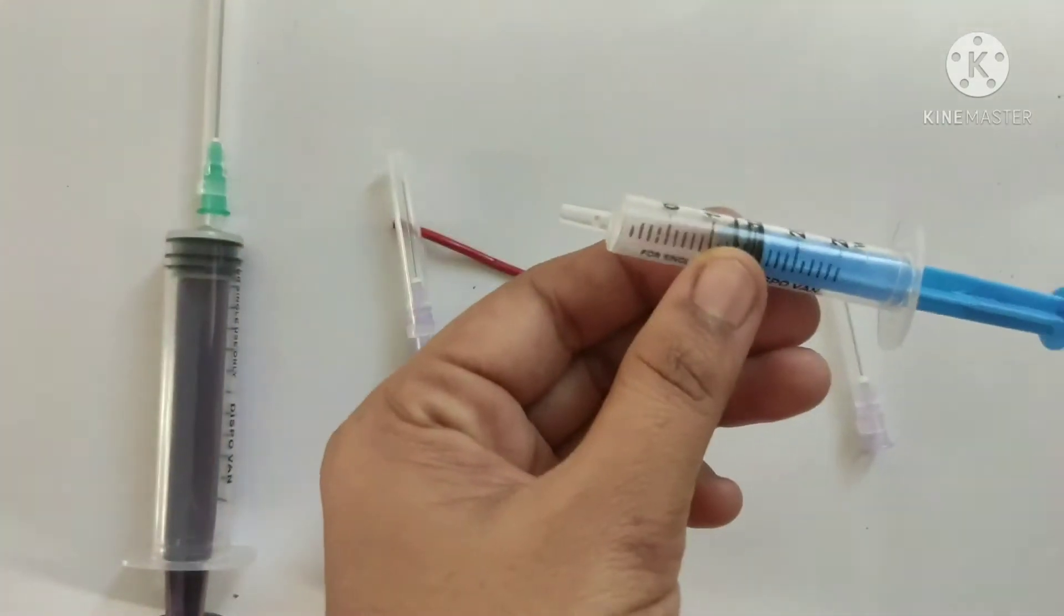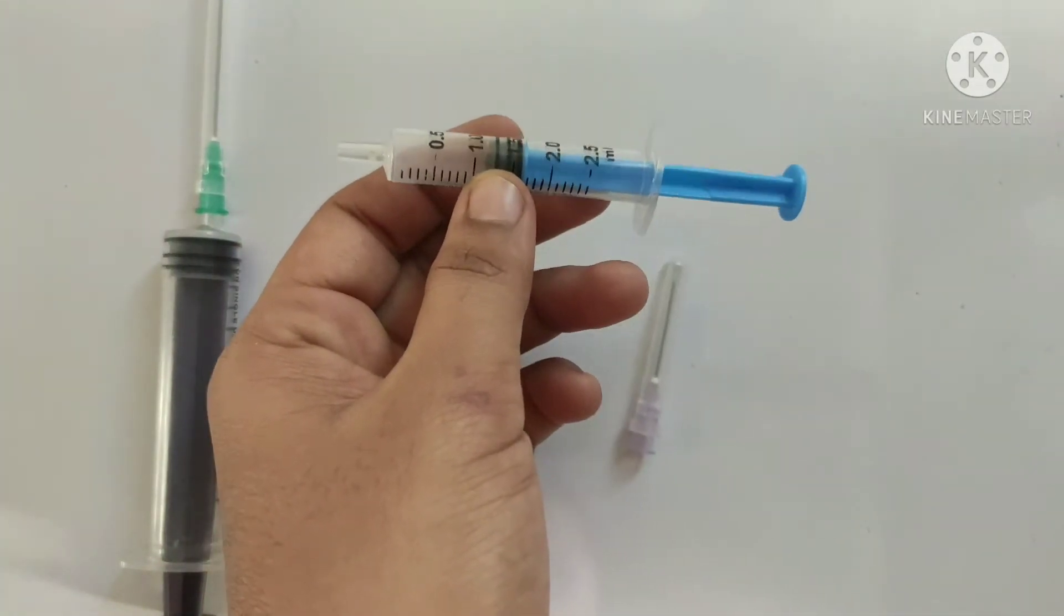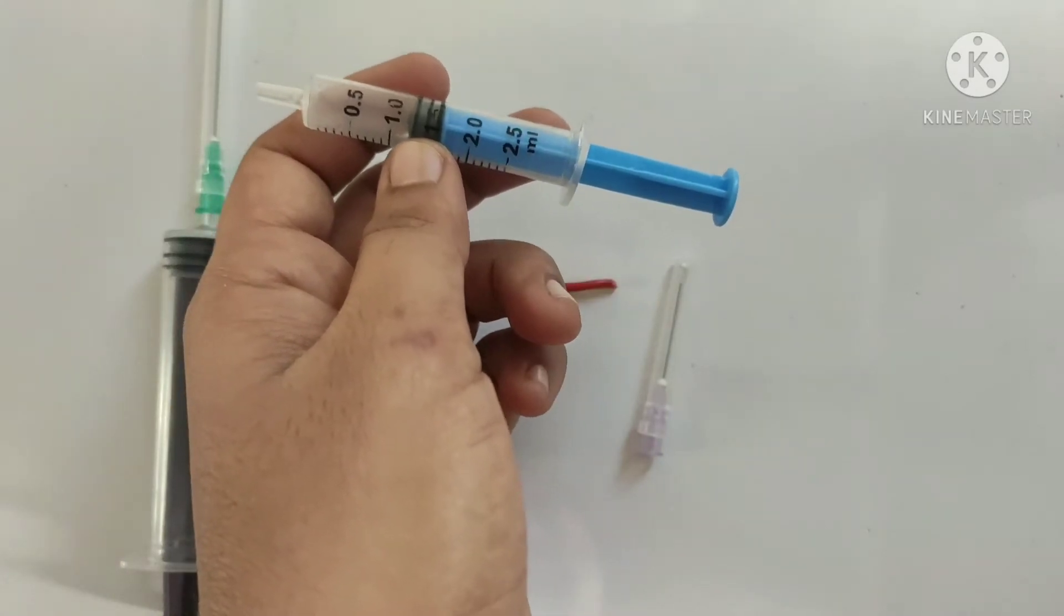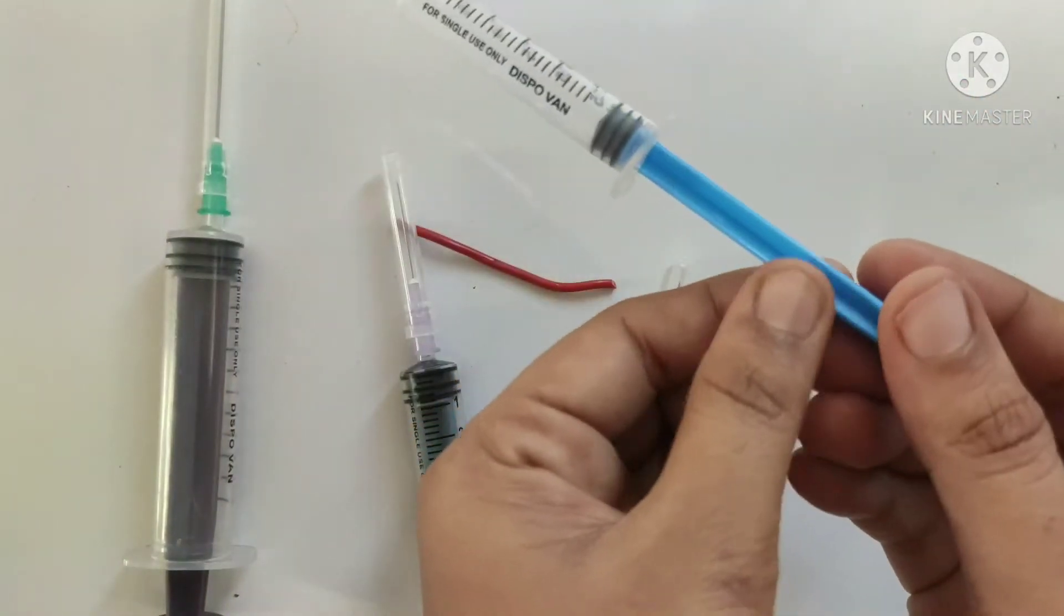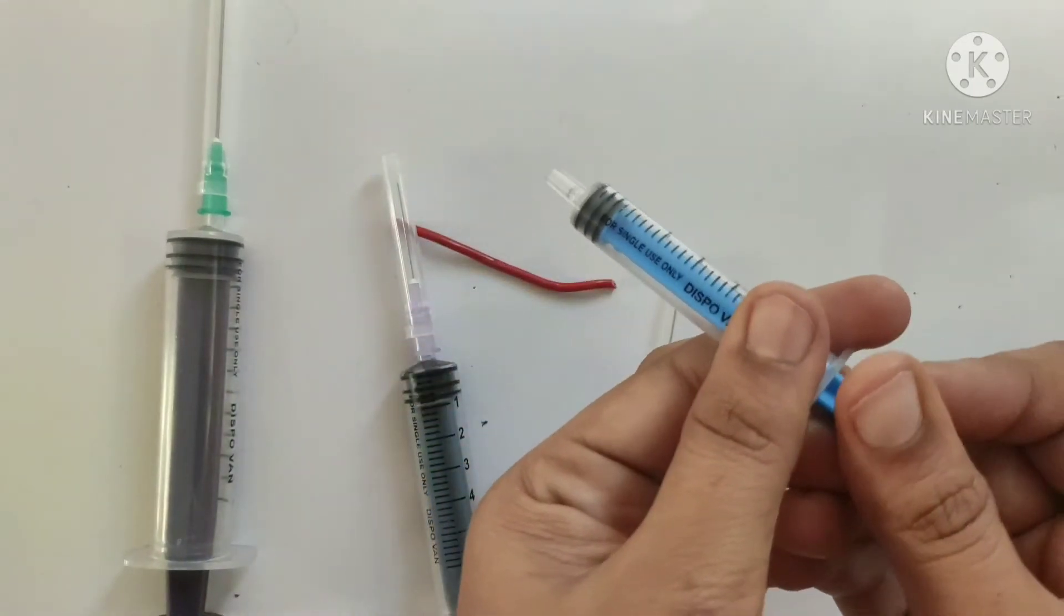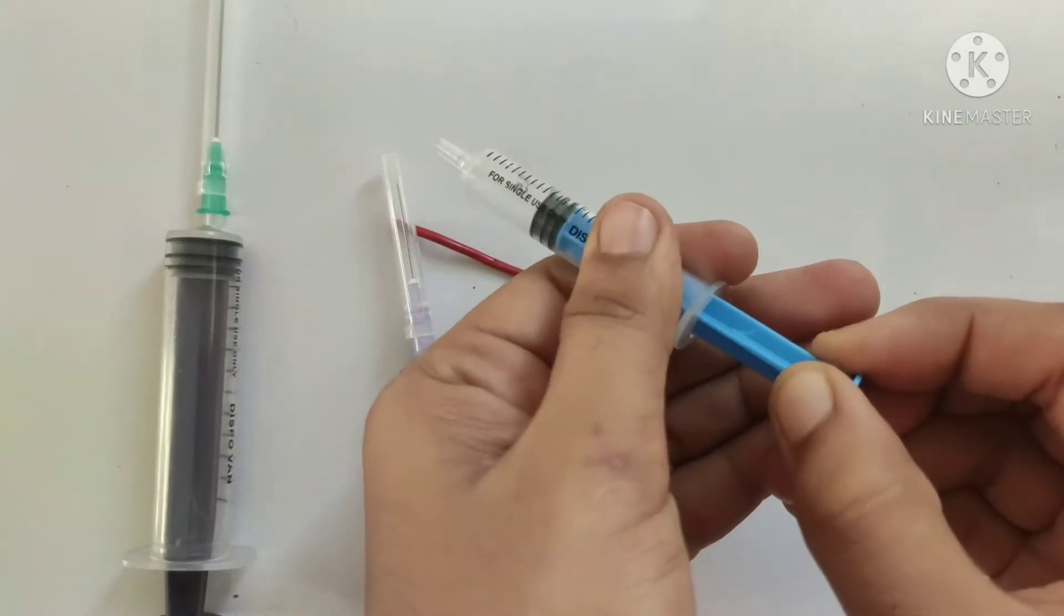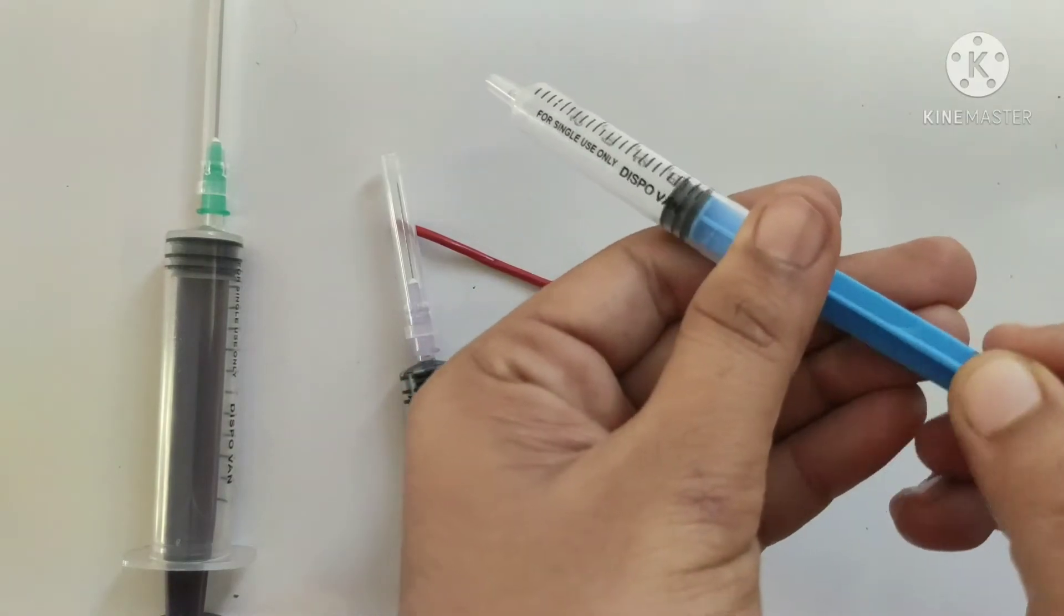This part is known as syringe. It is made up of three parts. This is known as plunger. Normally it is in this way. By pulling this, we can fill the drug within the syringe.